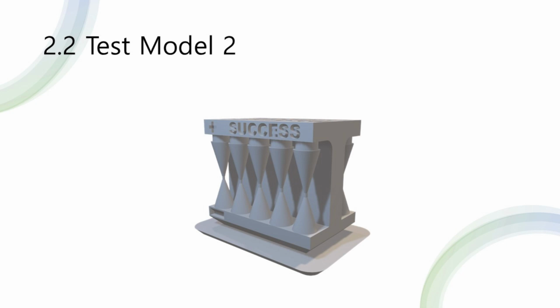This design element emphasizes how different thicknesses can withstand varying levels of stress, showcasing the impact of exposure time settings on structural strength. The varying thicknesses in this hourglass-shaped connection visually demonstrate how different exposure times can affect the model's structural integrity and durability. This serves as an excellent example of the importance of fine-tuning in the 3D printing process, clearly illustrating how exposure time influences structural stability and the endurance of the product.